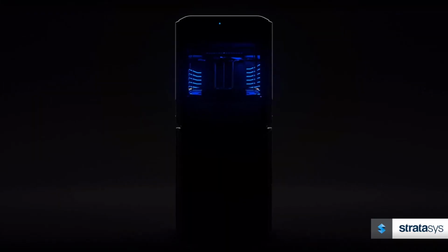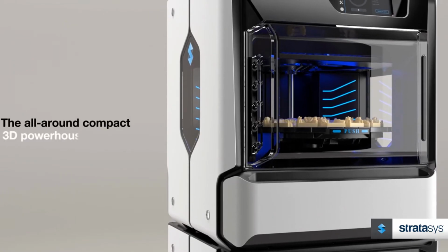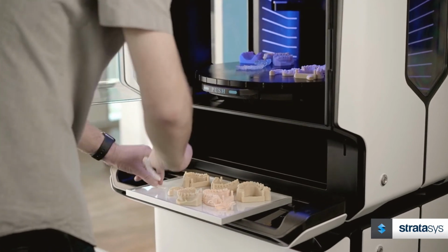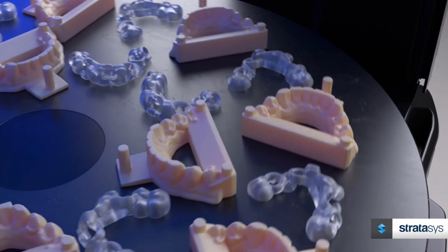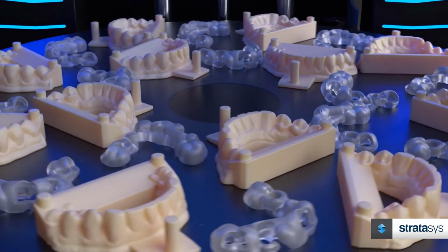The new J5 DentaJet from Stratasys is the most comprehensive and versatile dental 3D printer available today. It's fast, accurate, and doesn't require high levels of expertise to operate. With digital dentistry using Polyjet, labs can grow their businesses, produce exceptional quality models, and shorten their turnaround time.